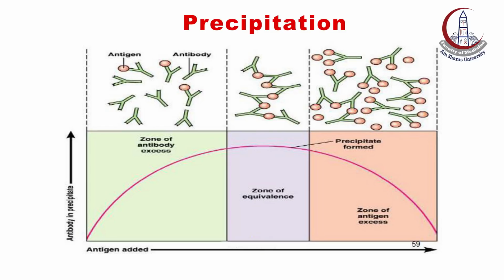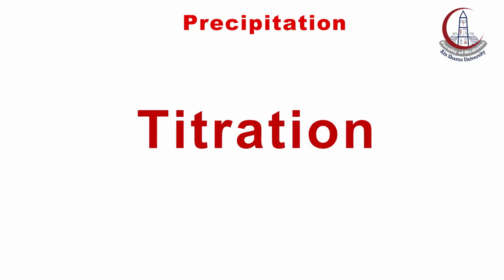In vivo, the precipitation of such complexes from the blood is critical to the trapping of pathogens and the initiation of the immune response in the secondary lymphoid organs, as well as the initiation of the pathologic phase of many immune complex-mediated diseases. In vitro, the kinetics of such reactions can be observed by titration or gradual measurement of antigen against its specific antibody.